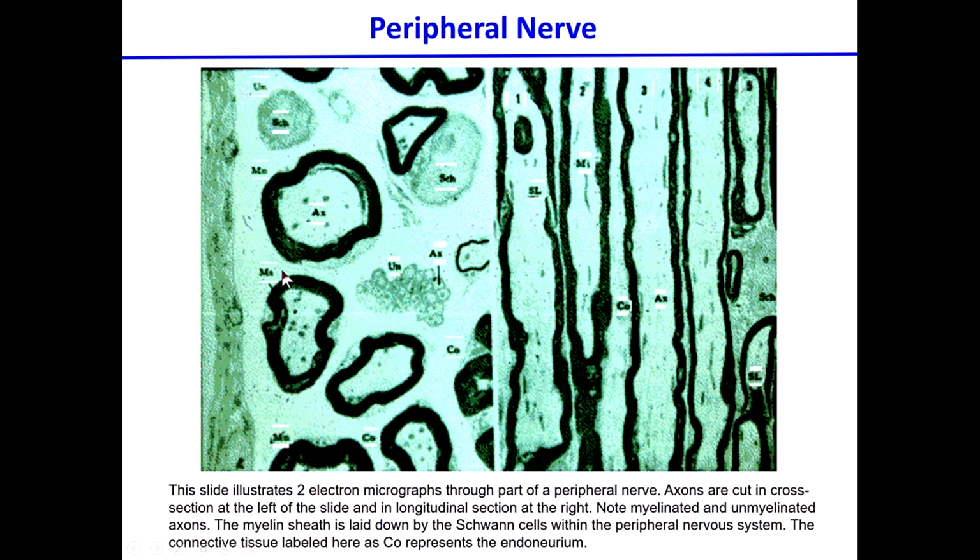In this case, we've been lucky enough that there is also an unmyelinated axon that has been captured in the image, and you see a significant difference between this one in here and the other ones in there. In this one you can see the Schwann cell, the body of the Schwann cell is showing, in addition to all the layers of the cellular structure that surrounded the axons to form this particular structure.